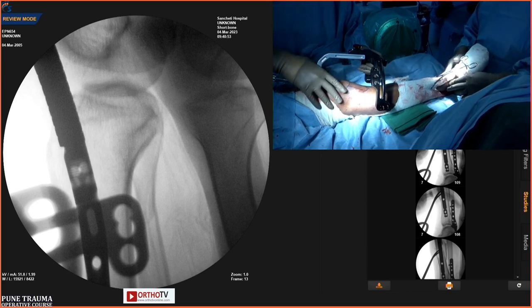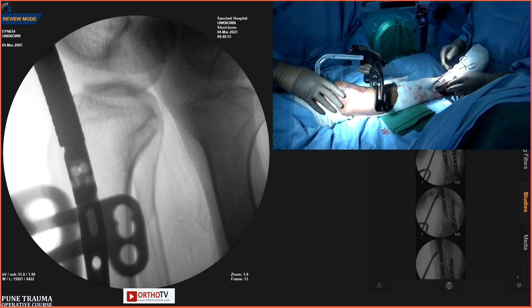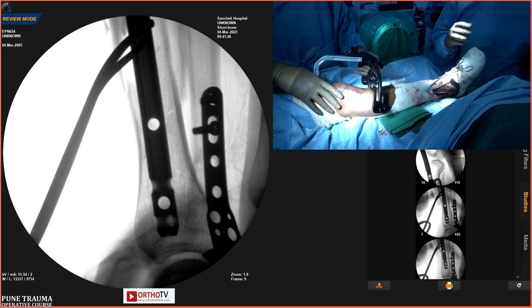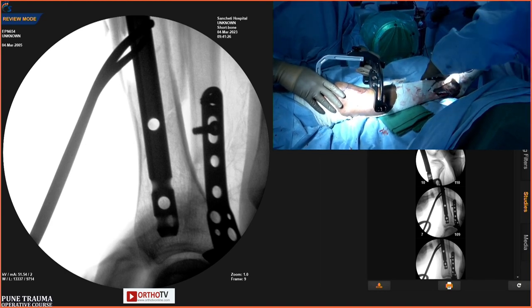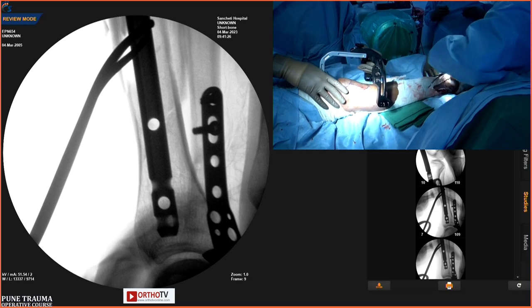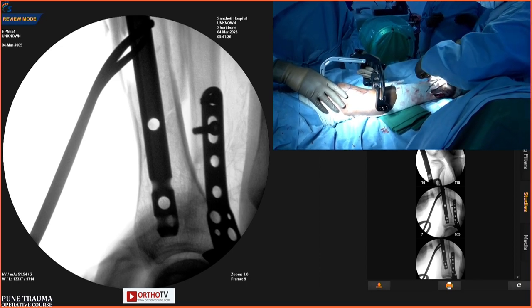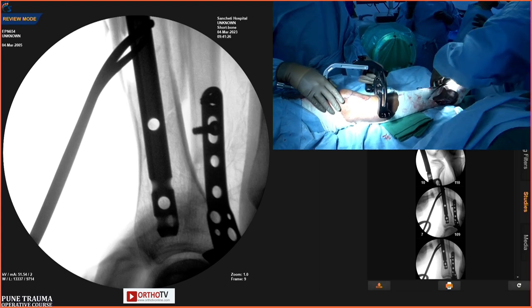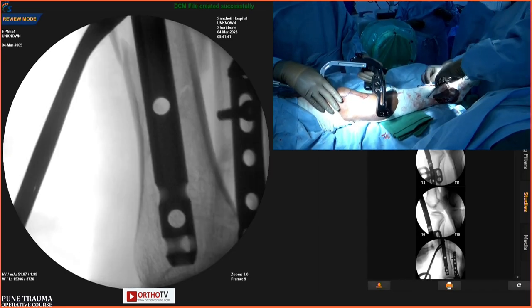In a comminuted tibia and fibula, I would strongly suggest you first fix the tibia into the anatomical position and then put the fibula back, because if you try to get the fibula into the normal position first, you may not be able to get the fibula back into position, and then the tibia position will not come properly. Perfect. Thank you, sir.